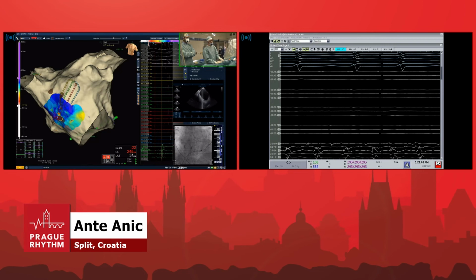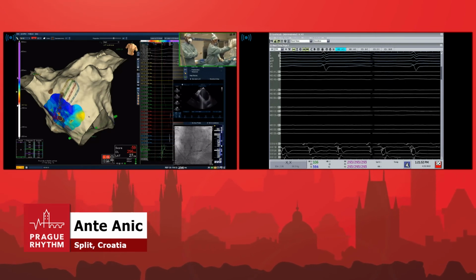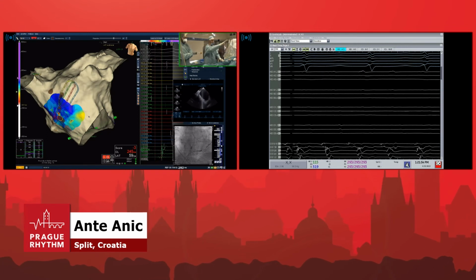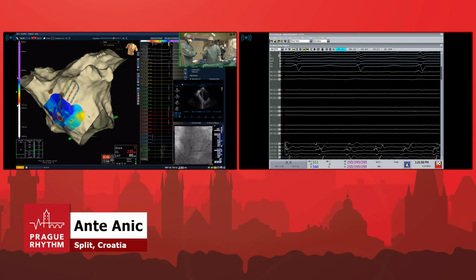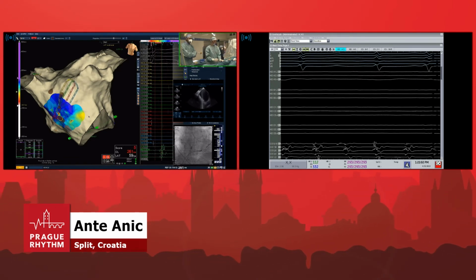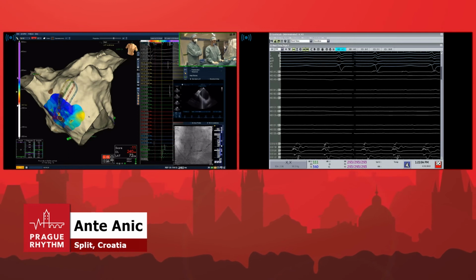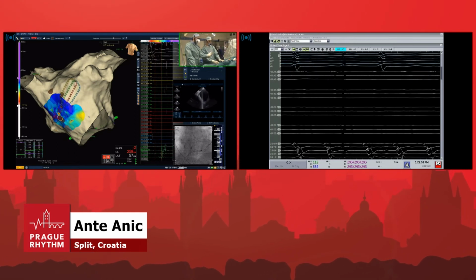Or we do extend the lesion set from the roof part, from the septal roof, gently anterior to encompass this part that we managed to see. It's inside. It's very fractionated, and there's no... Now we cannot map it. The problem is that we have this 35 millimeter catheter, and this will cover all this.